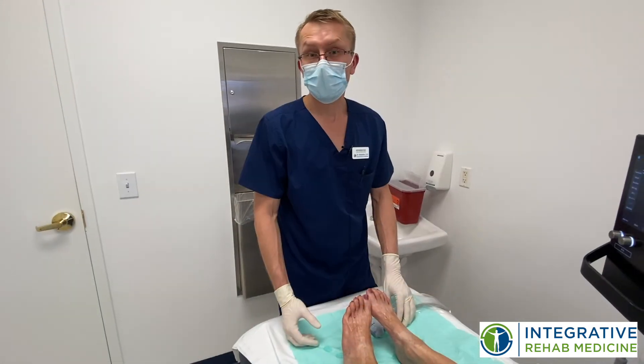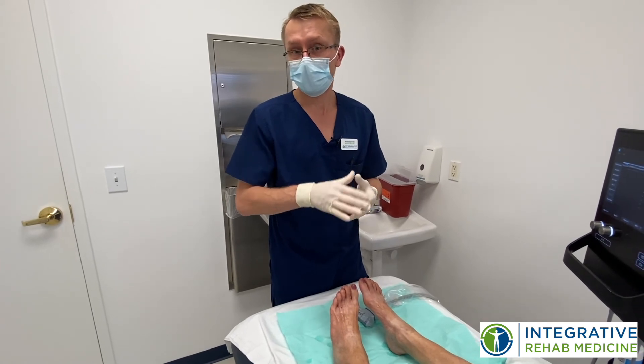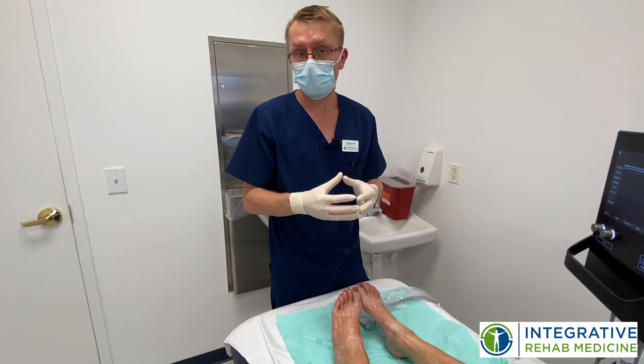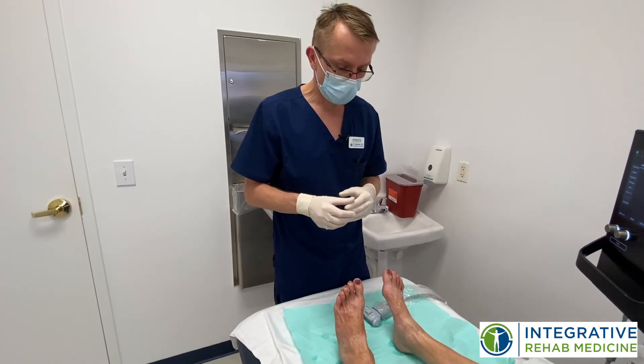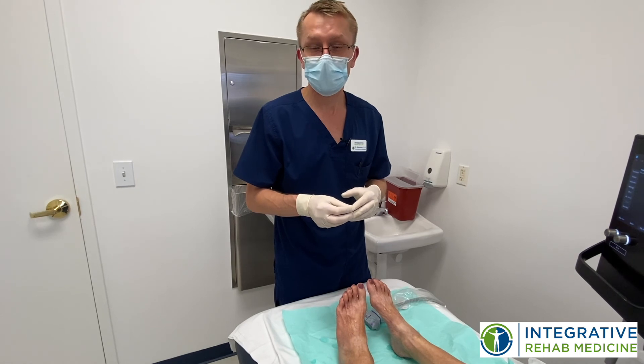So we are done with Lee's procedure. All the nerves of her legs have been hydrodissected and the plasma has been injected around the nerves. Now the plasma is going to start working by releasing all these growth factors, and it's going to stimulate the nerves to start regrowing and regenerating. Hopefully in a couple of months we'll see Lee moving a little bit better and dancing and having a good time.